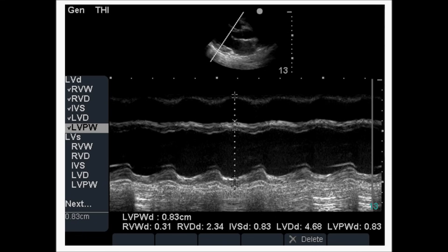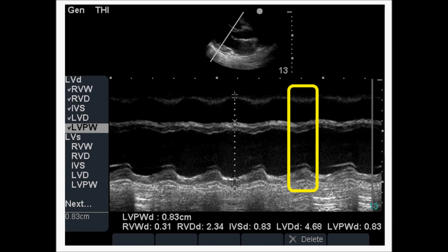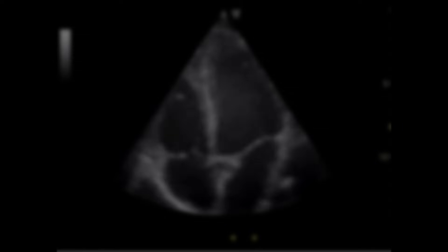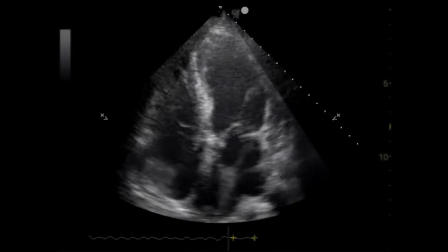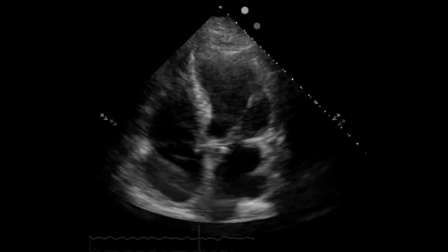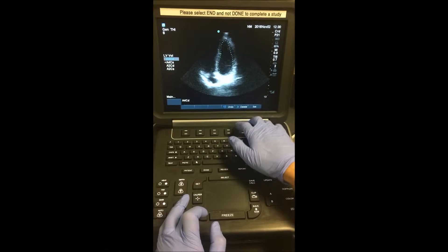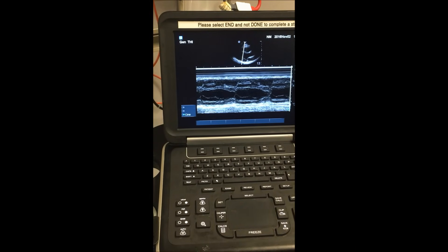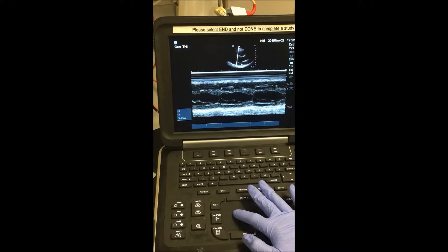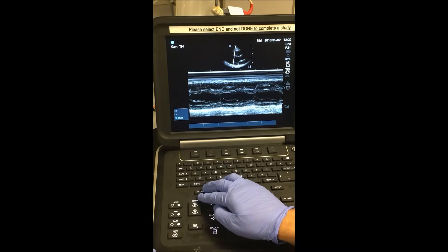By measuring these segments with the calipers, the machine will generate a calculated EF. We select CALC, then select LV for the left ventricle, hit SELECT, and begin using the calipers to measure each segment individually. The diastolic measurements are entered first, and then we find an area of systole and obtain those measurements, which generates the estimated EF. We have now discussed three methods of obtaining ejection fraction during point-of-care echocardiography: visual assessment, the Simpson method, and the M-mode method. With time and practice, accuracy will build and these can become a valuable part of your clinical repertoire.